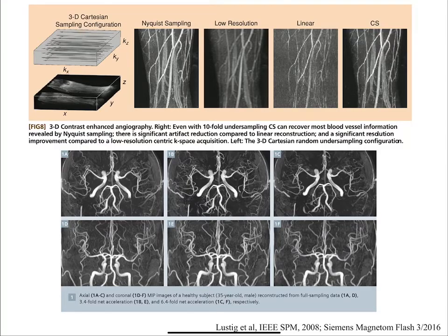I mean, you're collecting less data, so your signal-to-noise ratio will go down. But it's much better to acquire it quickly and have an image that doesn't have the kid moving around, versus if you acquire longer data but they're moving around, then your data quality is also going to be bad. So that's the idea, that speed.